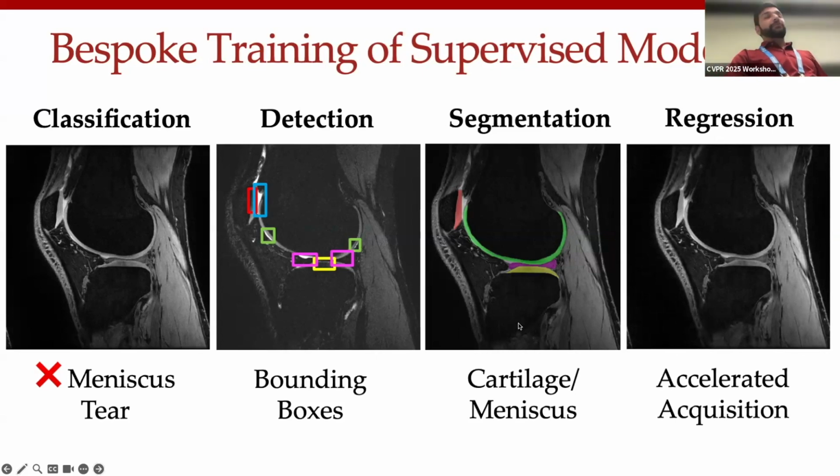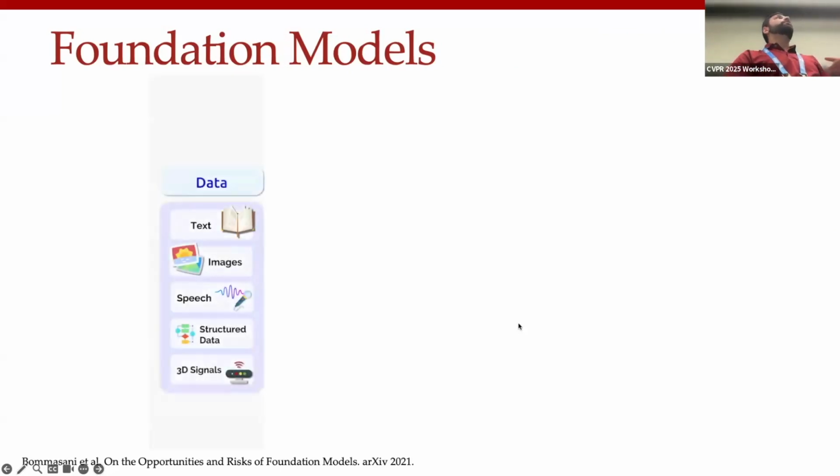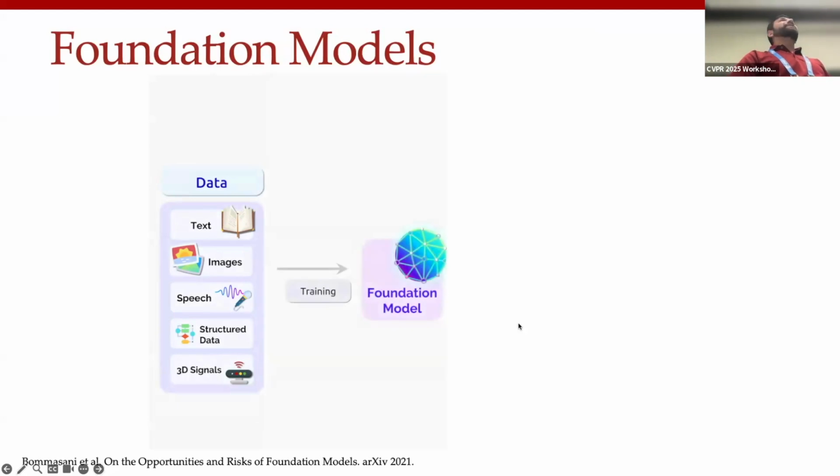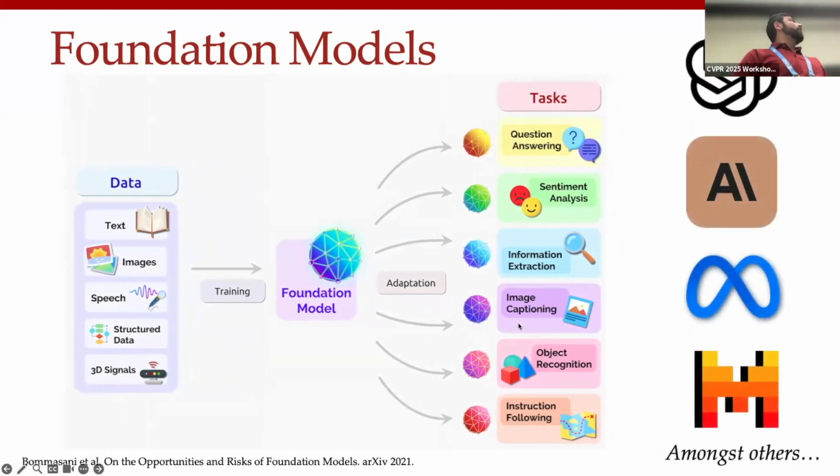So obviously it comes as no surprise that there's a lot of potential for current generation foundation models to be able to aggregate some of these insights. And I really don't need to go into too much detail for this particular group, where with foundation models, we can curate large amounts of unlabeled data sets and build different self-supervised learning algorithms to train these foundation models, which can be adapted either in a zero-shot manner or in a few-shot manner to solve a variety of different downstream tasks. And initially, when a lot of the foundation models we looked at, they really looked at language as the binding agent across multiple different modalities.